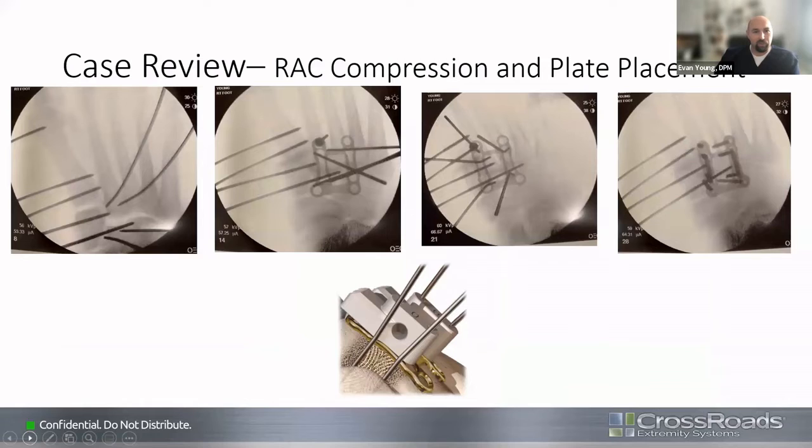This is sort of as we're going through the case. We took a lot of x-ray and saved all the pictures. Wanted to kind of demonstrate how, if you want to, you can prep all these joints. You can leave your pins in place for all of the compression, and kind of do them in whatever order you want to. Since this was my first time, I was kind of playing around with it quite a bit.